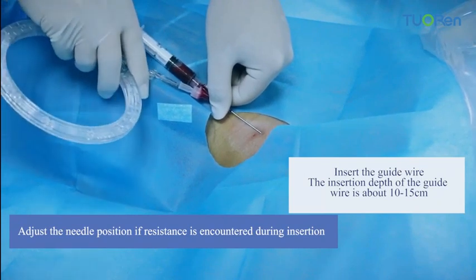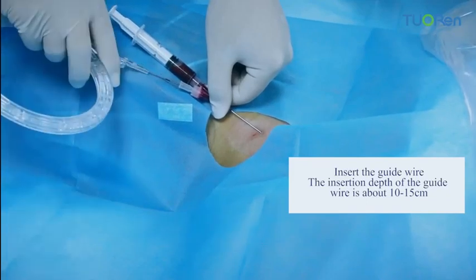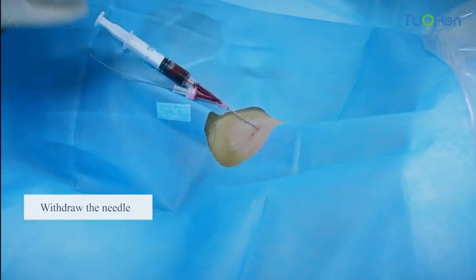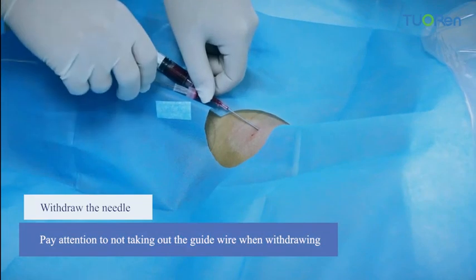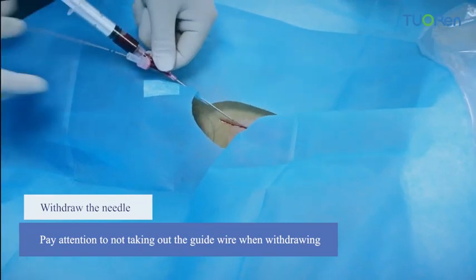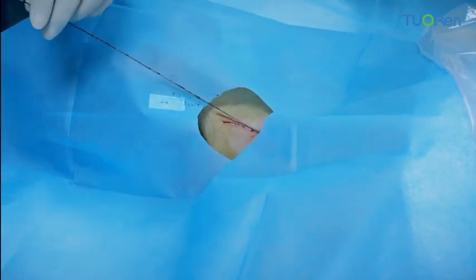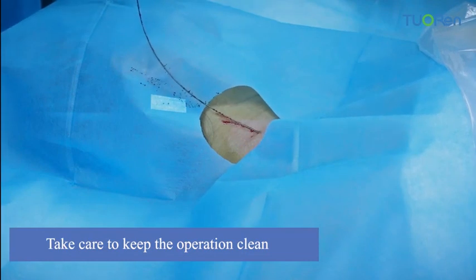The insertion depth of the guide wire is about 10 to 15 cm. Withdraw the needle. Pay attention to not taking out the guide wire when withdrawing. Take care to keep the operation clean.